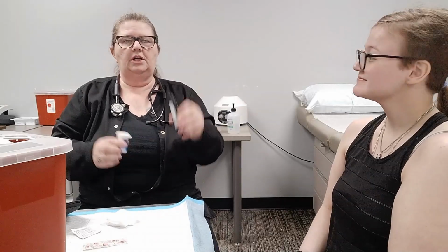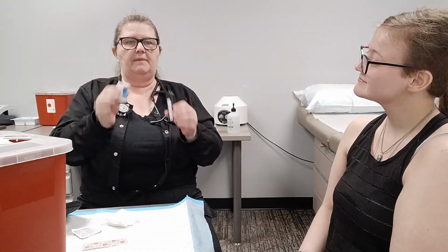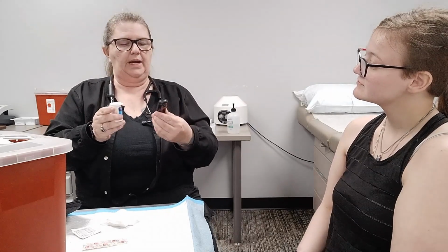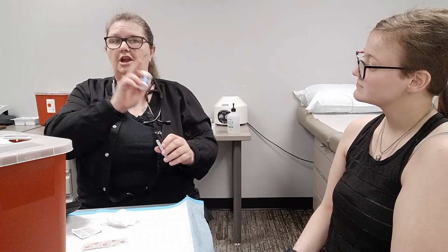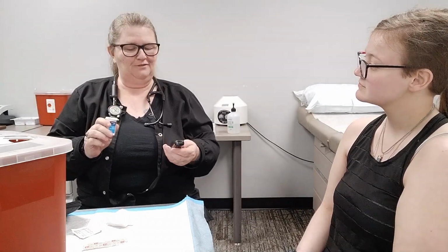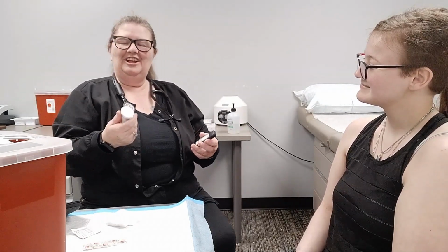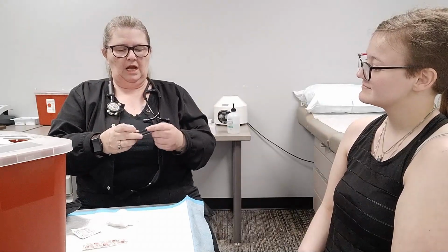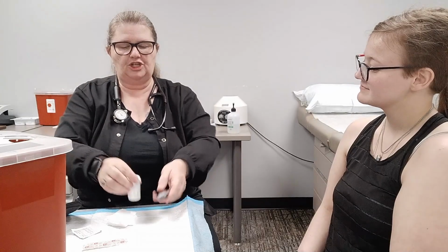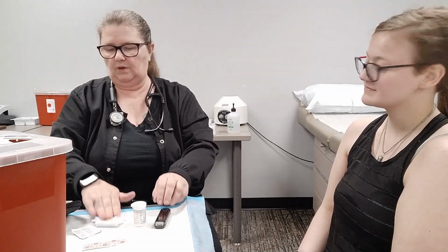Your glucometer and your strips need to match, meaning they need to be the same brand. So this is a Contour One, not advertising for them at all, but this is also Contour. So they need to be matching, otherwise they won't work together.